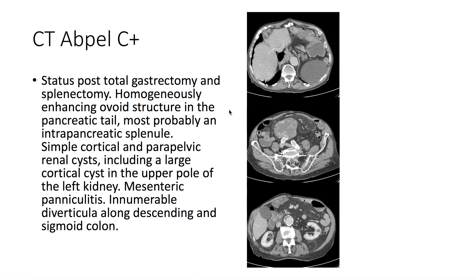Additionally, this patient was found to be status post total gastrectomy and splenectomy. There is a homogeneously enhancing ovoid structure in the pancreatic tail, most probably an intrapancreatic splenule. The patient also has cortical and parapelvic renal cysts, including a large cortical cyst in the upper pole of the left kidney. There is also mesenteric paniculitis and innumerable diverticula along the descending and sigmoid colon.